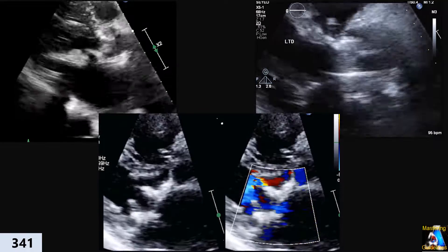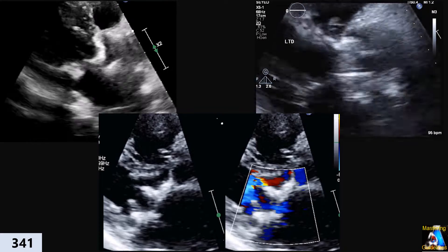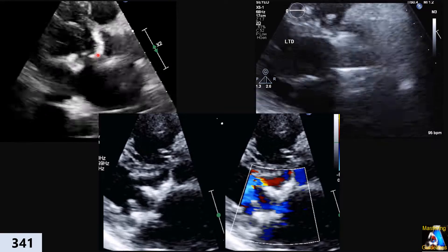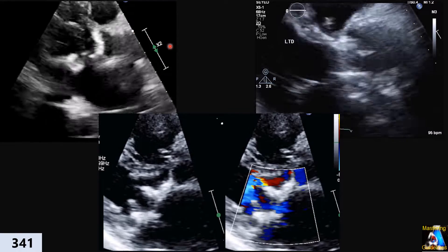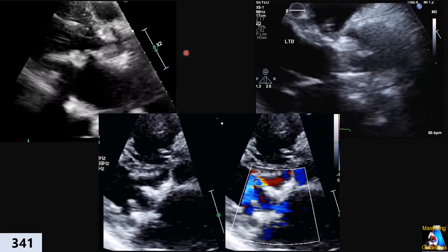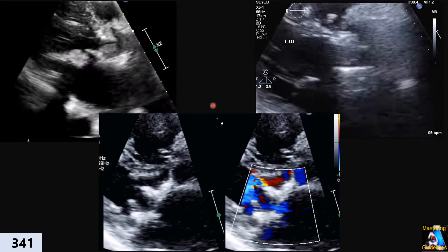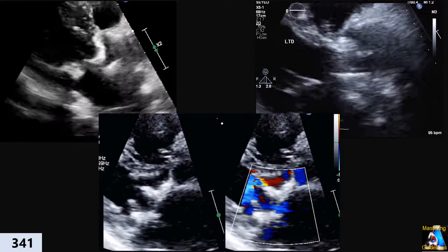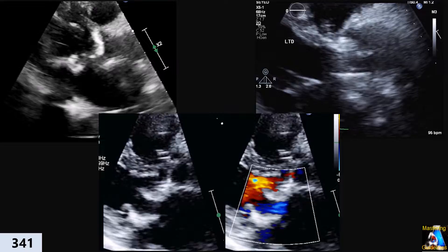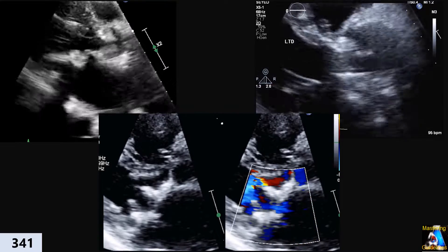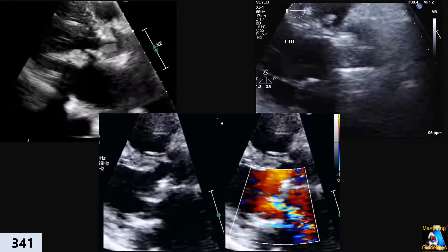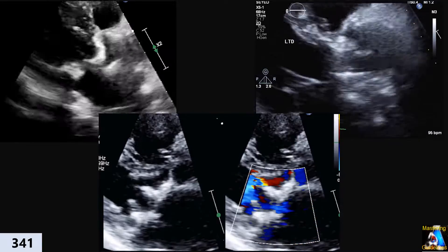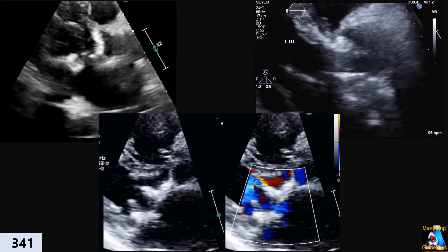They ask about the LVOT measurement, especially in those cases where the LVOT structure is completely not clear — we have calcification, or in those cases where we have mitral valve replacement like this one, or they have both valves replaced, mitral valve and aortic valve replaced. Is there any rule we can use for measuring in a correct way, especially in those cases?